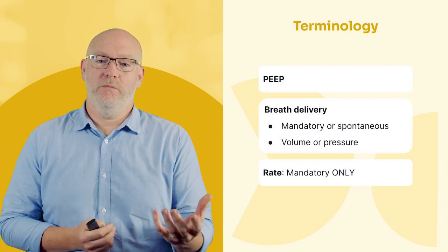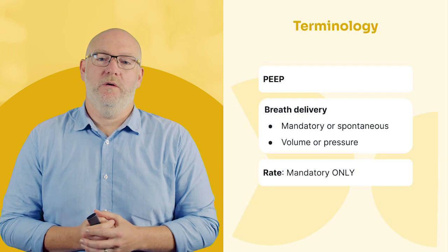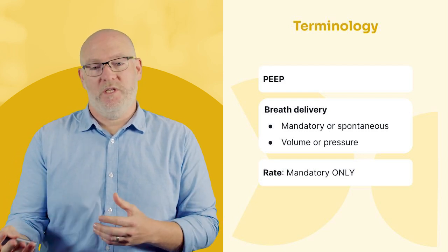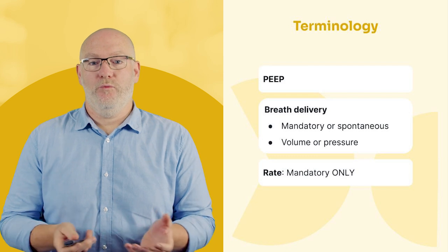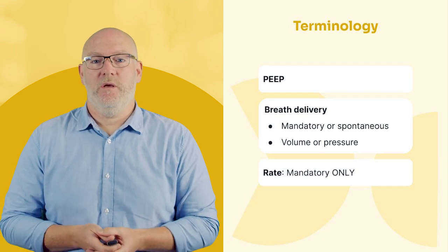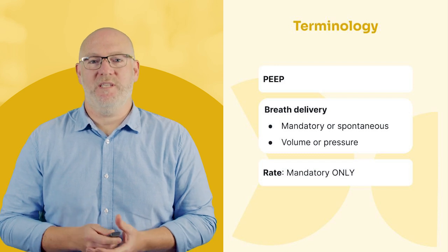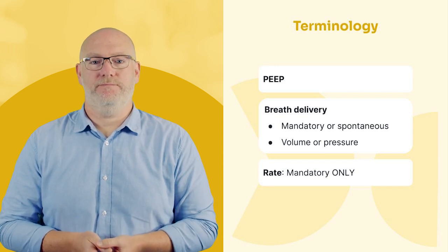Then we have volume or pressure delivery. Volume, we're setting a volume on the ventilator. In pressure, we're setting a pressure. Rate is fairly self-explanatory, but important to note that we're only worried about rate in a mandatory mode where you are setting the rate for the patient.